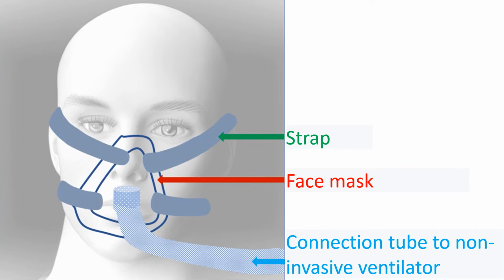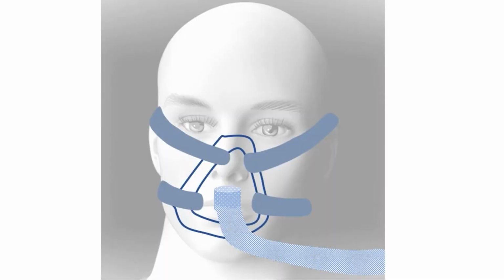Small non-invasive ventilators running on mains with battery backup are being used by many sick long-term care patients at home. Caretakers can be easily trained to apply the mask and check for air seal. The advantage of non-invasive ventilation is that the individual can remain fully alert without any need for sedation or anesthesia. There is no need to place an endotracheal tube and hence it can be initiated quickly by minimally trained persons.